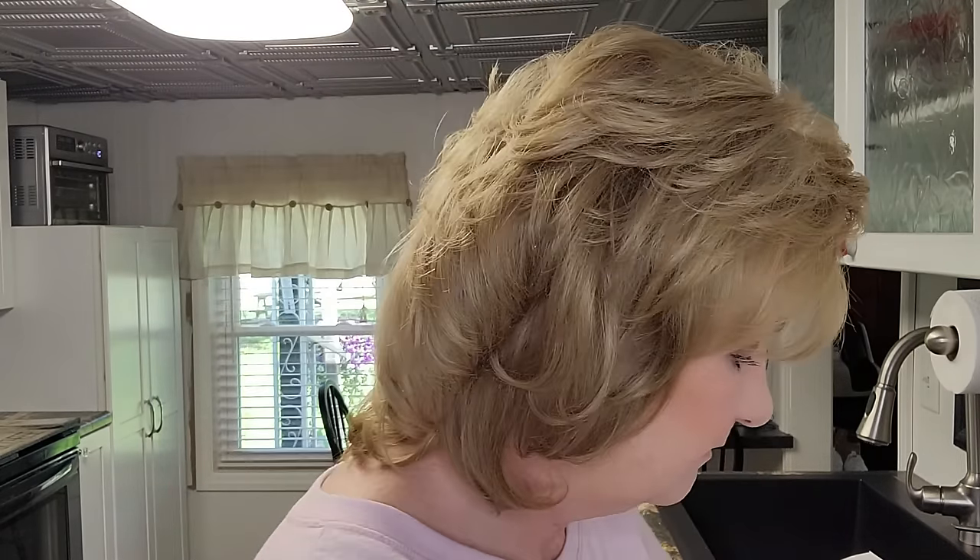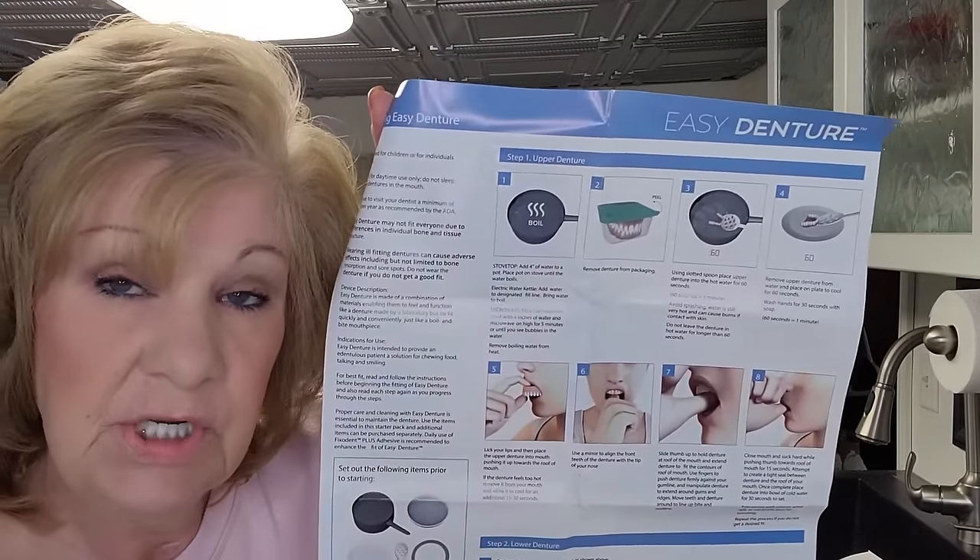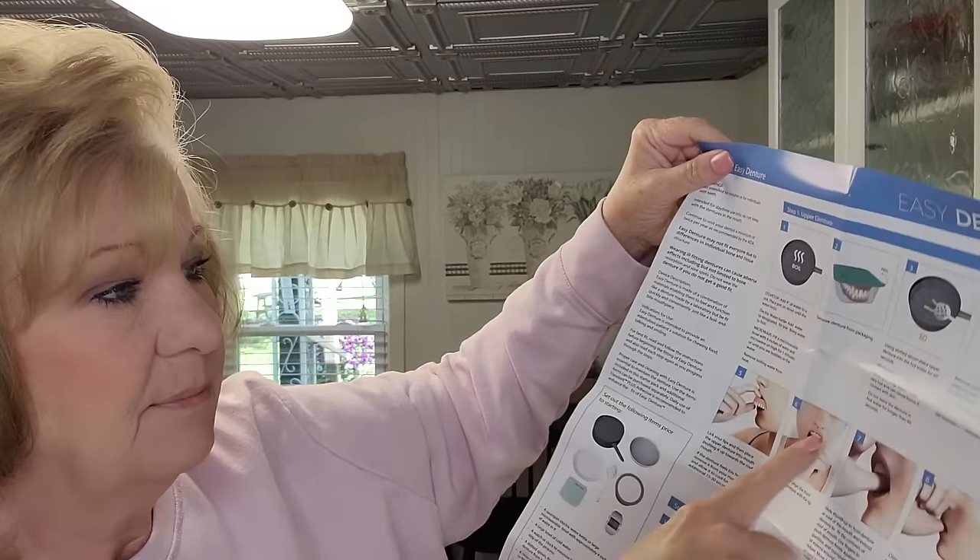When you get the kit — I'm going to leave a link to their website — you can tell that the teeth are not polished. When they made this design they found it worked better not polishing the teeth. But they do send a polishing cloth that you can polish them yourself. Also your saliva itself will make your teeth shiny. In the kit comes the polishing cloth and very detailed instructions with pictures and step-by-step instructions.